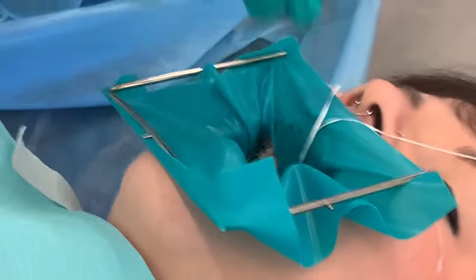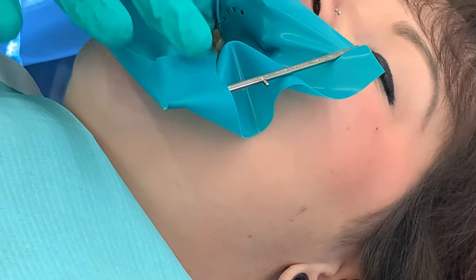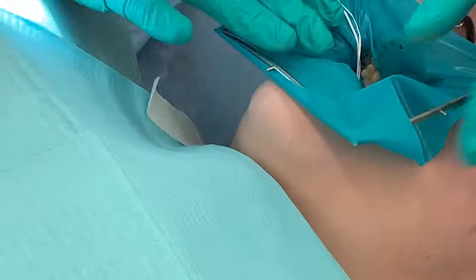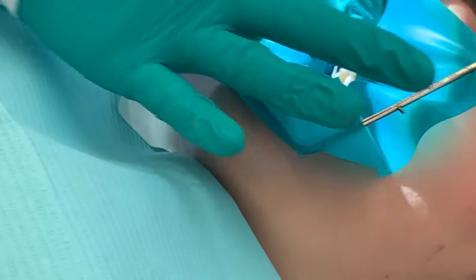So now that's on. Get this floss out of the way. Now with it also over the frame, it makes it easier to put in between the teeth.